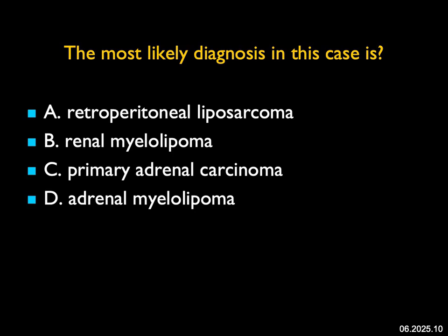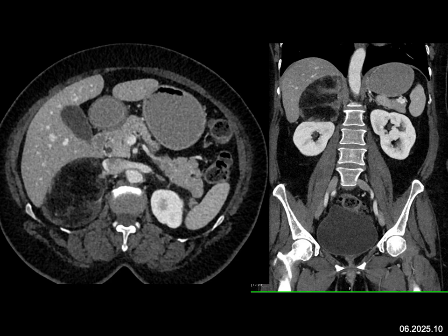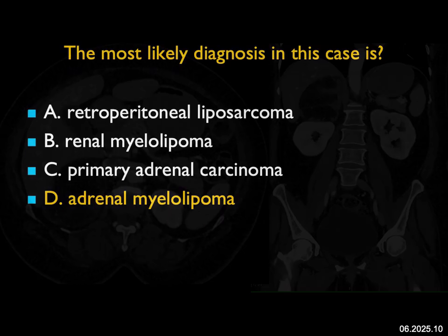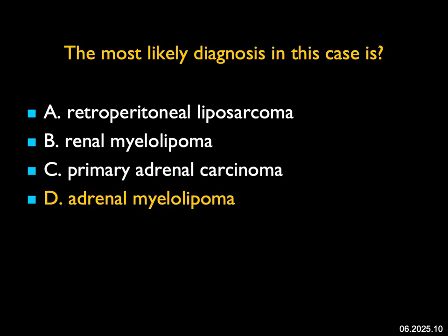The most likely diagnosis in this case: on the axial views there's a large fatty tumor by the adrenal bed, and on the coronal views you see it's pushing on the kidney and is in the adrenal bed. I don't think it's a liposarcoma because shape-wise and position-wise it appears to be coming from the adrenal gland. It's not a renal mass like a myelolipoma pushing up. Adrenocortical carcinomas can theoretically have fat but in a minimal amount and are aggressive. This lesion is 90-plus percent fat, making it an adrenal myelolipoma. With myelolipomas there's no risk of malignancy, but there is risk of bleeding — once a lesion exceeds 5 centimeters in most series, it should be resected.